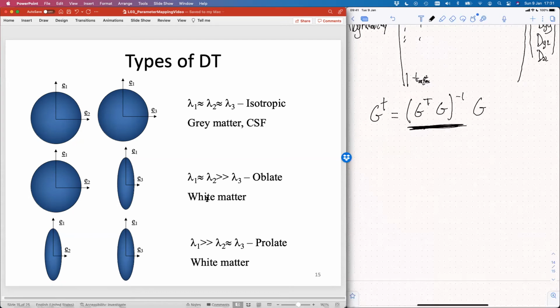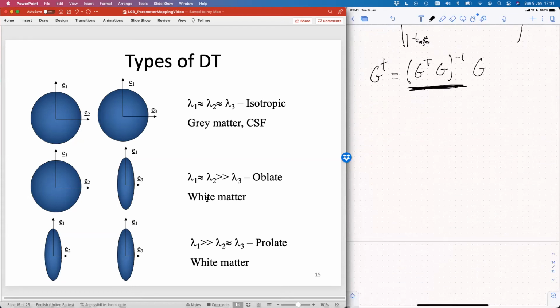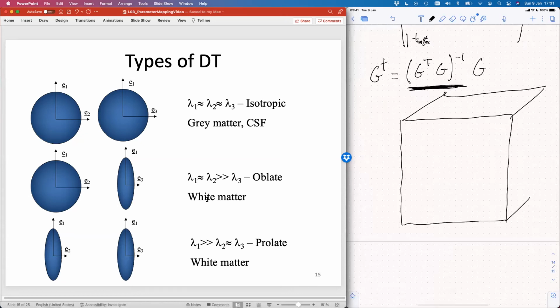the size of the fiber and cellular structures that we're thinking about are much, much smaller than the size of an MRI voxel. An MRI voxel is typically a couple of millimeters across in each of its sides, whereas the individual nerve fibers are more typically something like 1 micrometer across, or maybe a couple of micrometers.